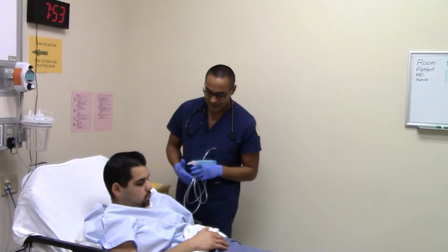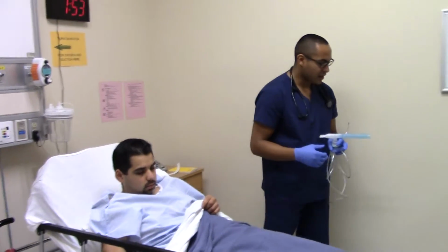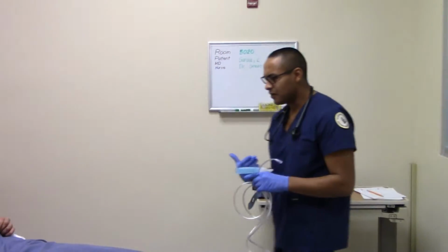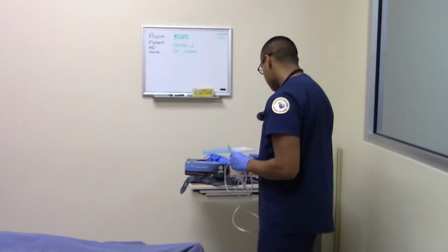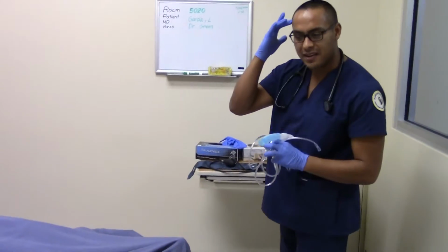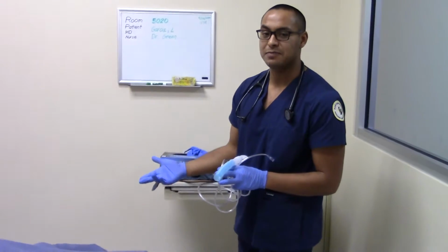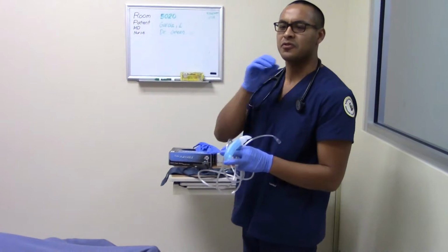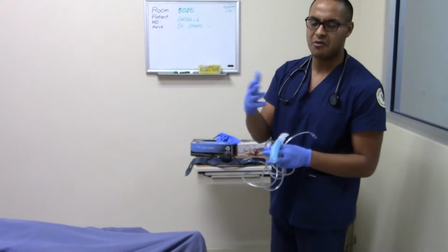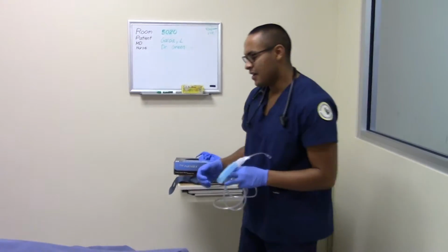How do you feel, Christian? A little better? Okay, do you feel you have phlegm right now? No phlegm? Okay. That tells me he could do the peak flow meter right now. If the phlegm was built up, I would have him cough it up. So his airway's clear, he feels good, breathing better.